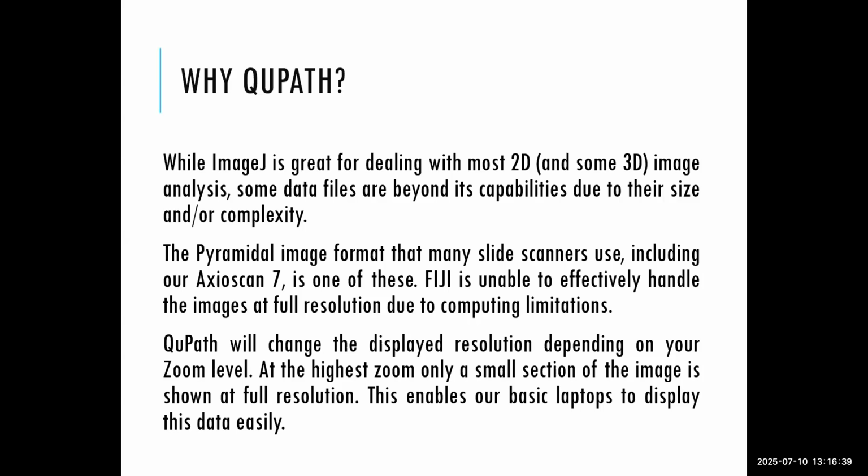QuPath will change the displayed resolution depending on the zoom level. Essentially, when you're really zoomed in, it will only show you that particular part of the tissue. Then when you zoom out, it will show you the whole thing, but at a very low resolution, which allows basic laptops to display the data very easily. So I can run QuPath quite happily on my very basic La Trobe laptop.